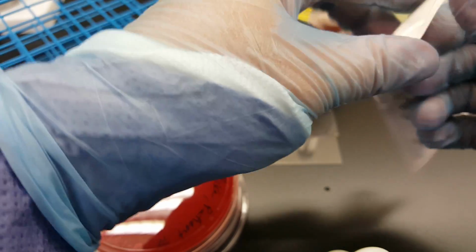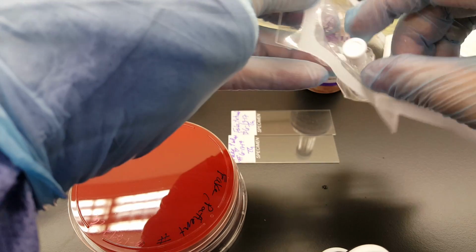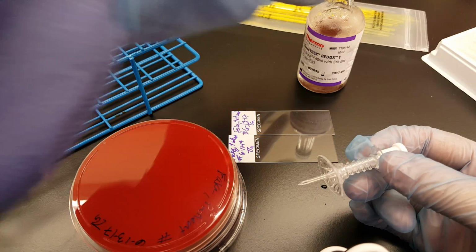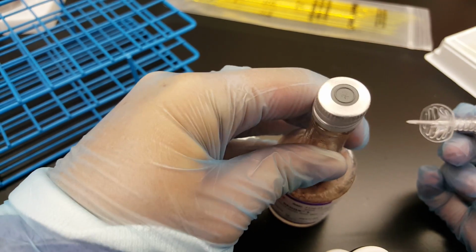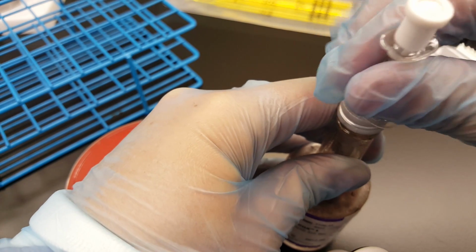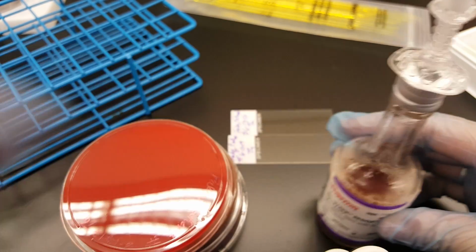this sub unit, open it up, and see it has a little needle-like projection here. That's going to go into the top of this blood culture bottle. So it's dry and ready, so we're going to puncture the top, which keeps the suction in the bottle, okay?